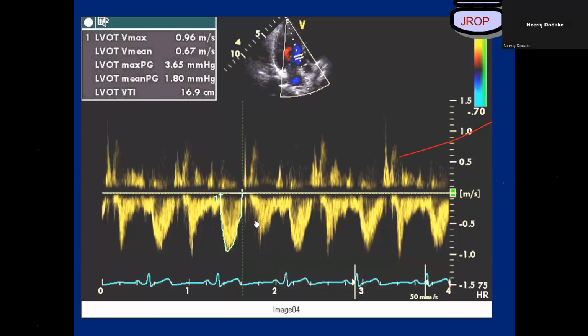Okay. So by increasing the gains, we mean that the contrast is high. We need that, but at the same time, for better visualization, extra gains also appear. So we need to reduce these gains. Try to remember these things when I'm showing a live demonstration. I'll try to show all these things.